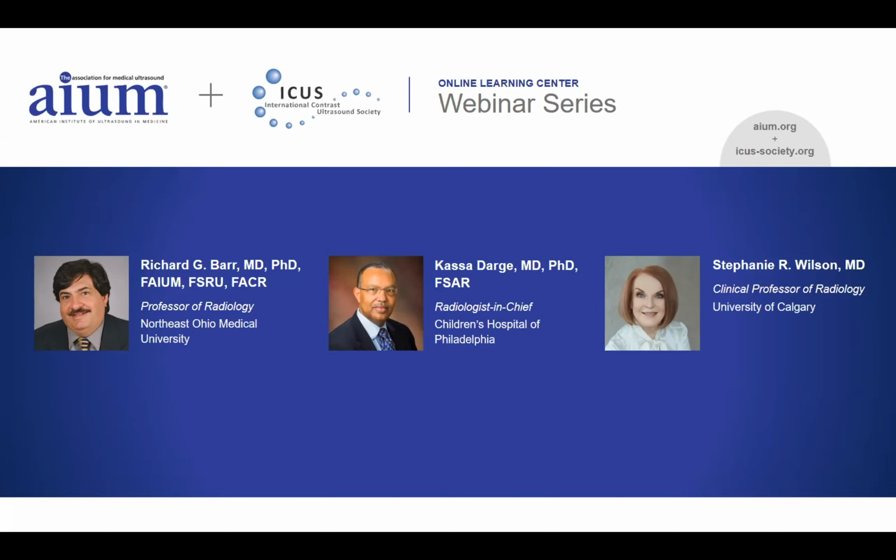I've been doing this full-time since just around 2000, and I believe Richard has, and Kassa, you have been doing it for a very long time as well. I will say very comfortably that certainly we have minor adverse events, but I have not at this point had any major adverse event in spite of the fact that we inject up to 20 people a day, not on just one day of the week, but every day. So it's a great safe thing. So Kassa and Richard, throw in your 2 bits about this.